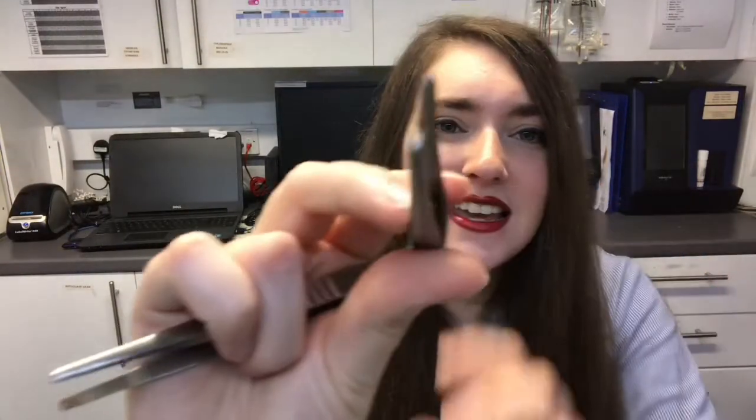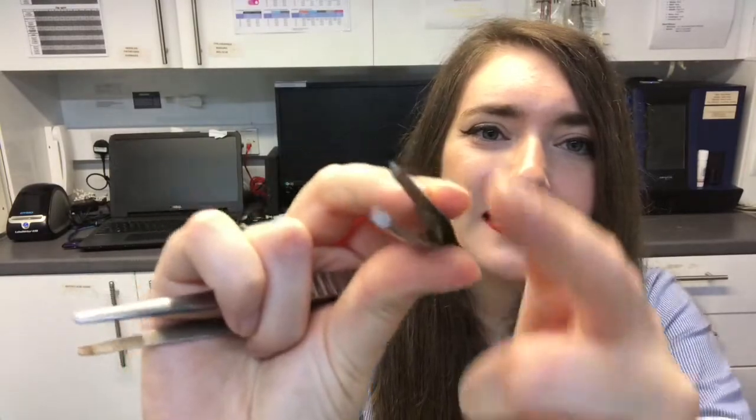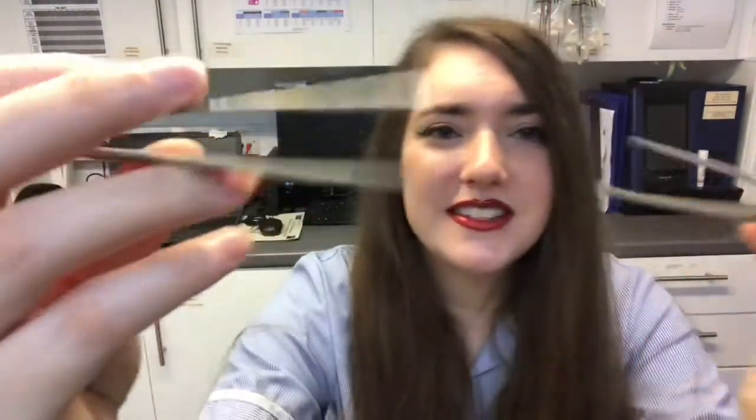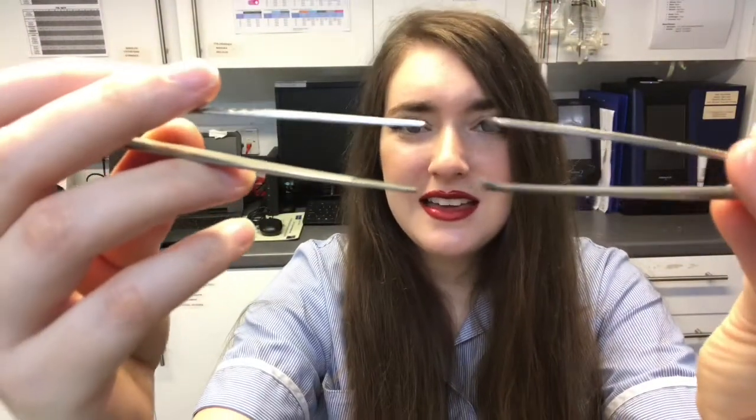We also have some smooth forceps and some rat tooth forceps. As you can see, it's got a little tooth there — that's the difference between the two. This allows the vet to move the tissue around during surgery instead of using their hands.